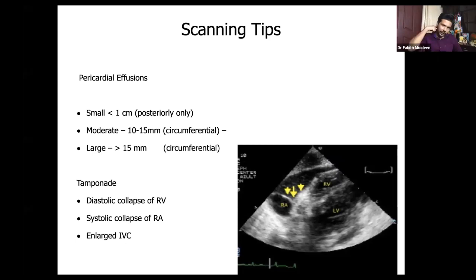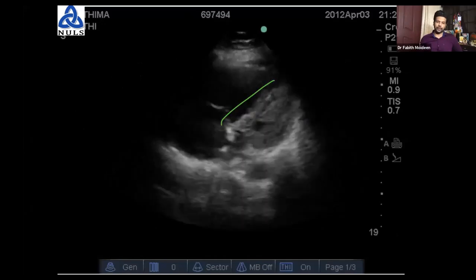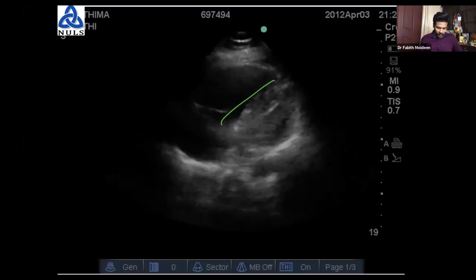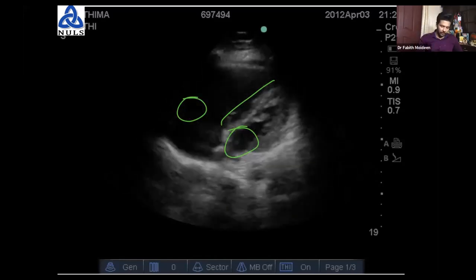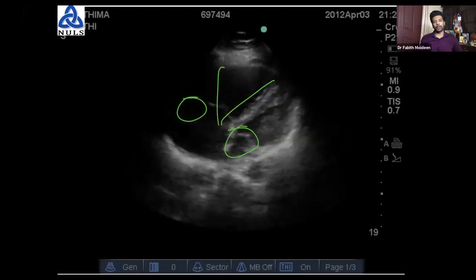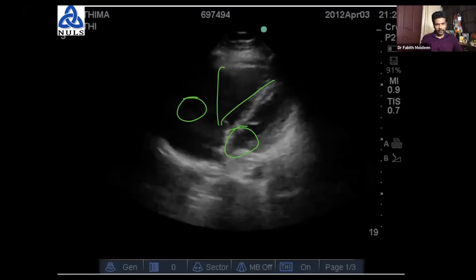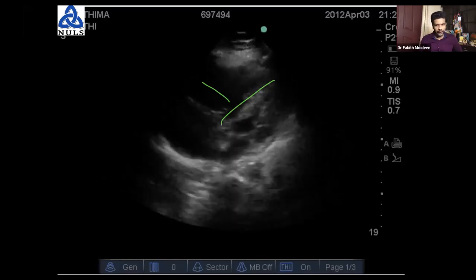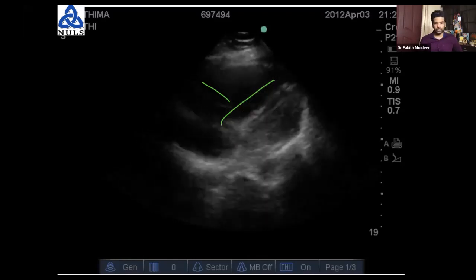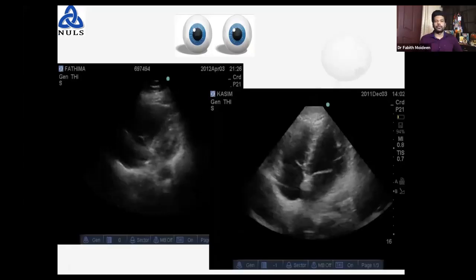Okay, so this is again not exactly, you will tell me that it's not a 4-chamber view because the septum is tilted. So I cannot comment. I can see the mitral valve, I can see the tricuspid valve, but I don't see the septum perpendicular. I see it slanting. So probably it is a subcostal view also, or my view is not correct. But I can definitely say that there is a dilatation of the RV because it's hugely dilated. So there is RV dilatation for sure. All right, but I agree with you that it's not a typical 4-chamber view.